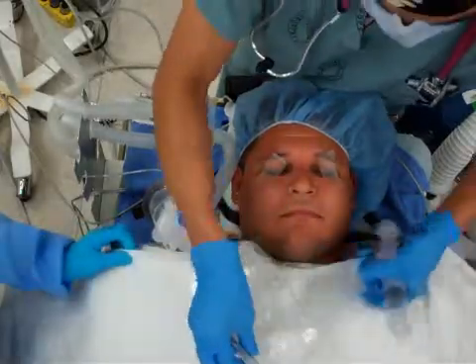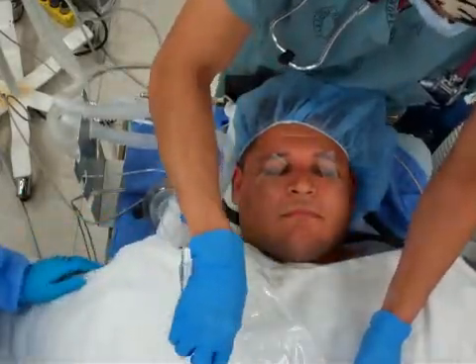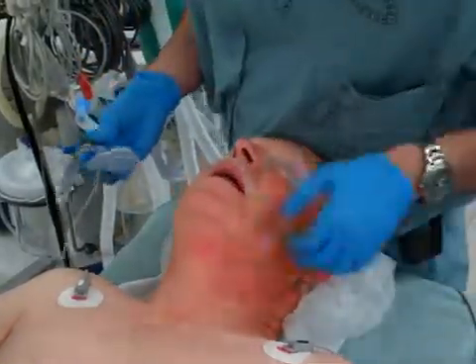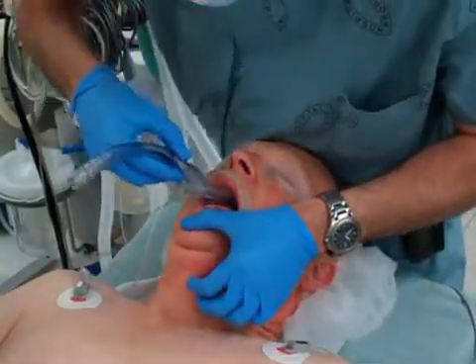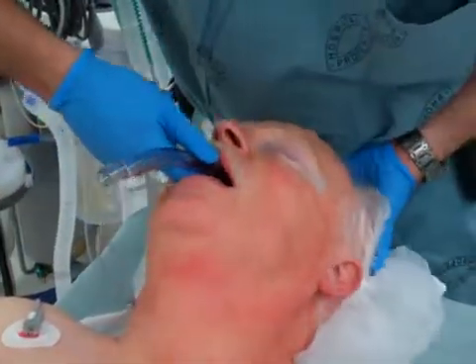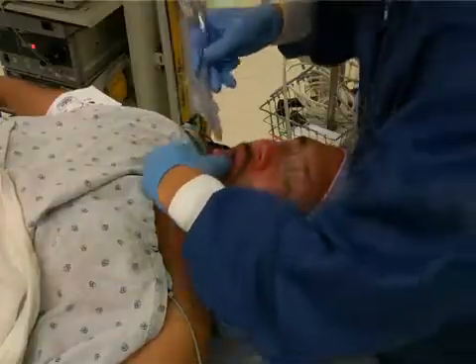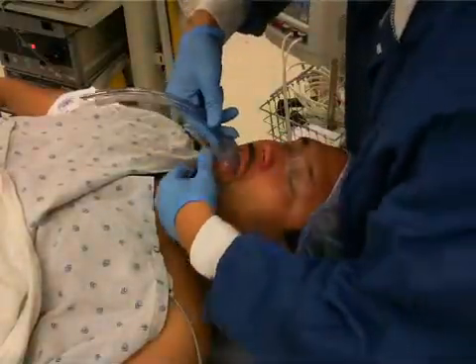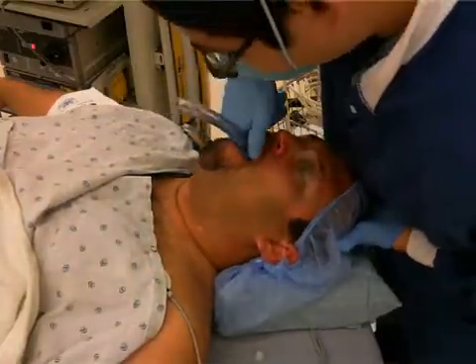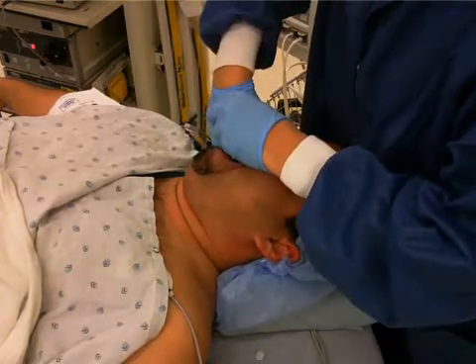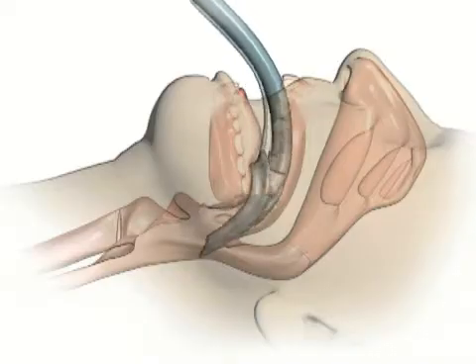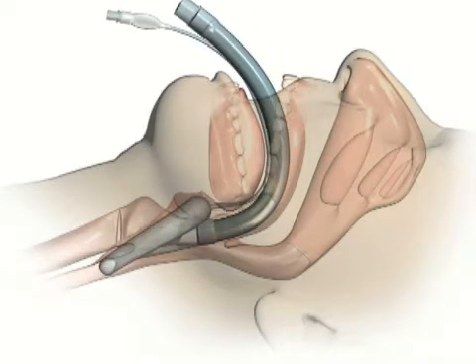The following sequences demonstrate placement of the laryngeal mask airway in consenting adults undergoing elective surgical operations. With the patient in the supine position, gently tilt the head backwards to facilitate placement. Do not perform this backwards tilt in an unconscious patient in whom a neck injury is suspected. To place a straight laryngeal mask airway, open the mouth as fully as possible and insert the device directing the posterior cuff against the hard palate. Continue until you feel the cuff pass behind the tongue completely and then until you meet resistance. Keep the leading edge flat to prevent the cuff from folding on itself, and exert firm pressure against the hard palate during passage.